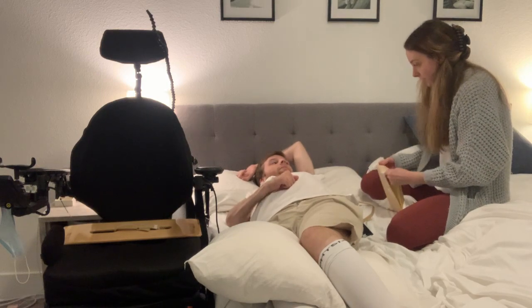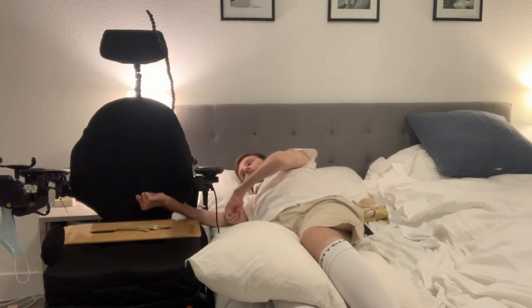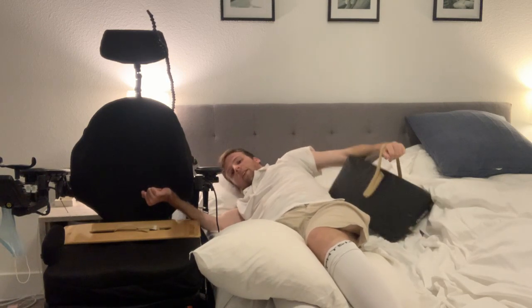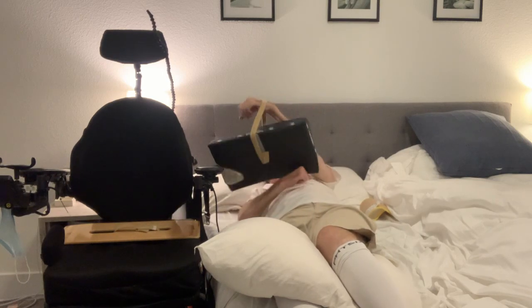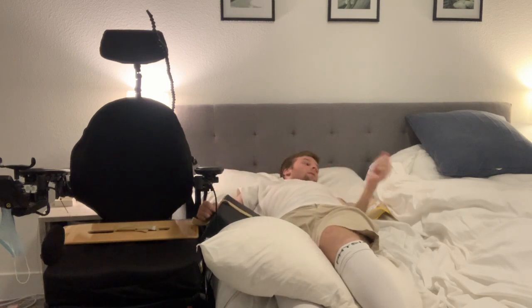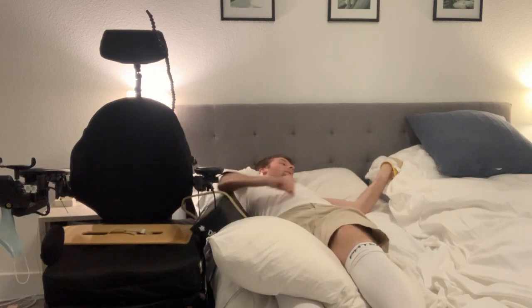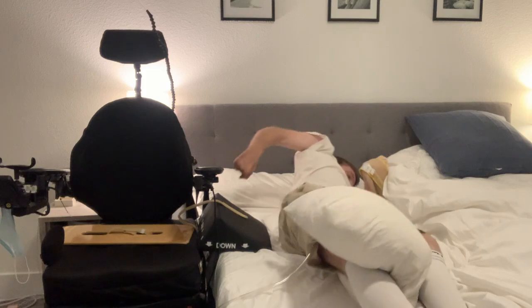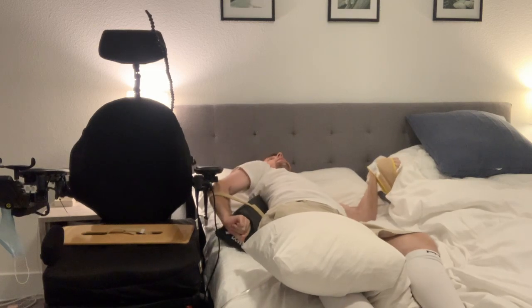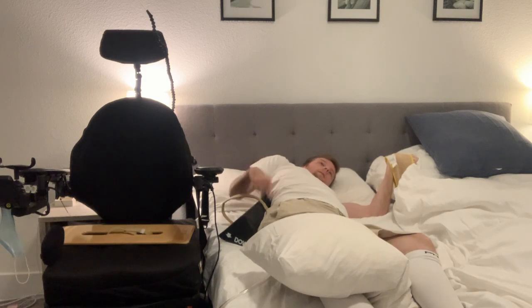So here's my independent middle-of-the-night roll-over: using my chair, I pop that out, put my hand in the strap so I can pick it up, fall on my back, set the wedge over here, then grab onto the Posey strap and roll myself over. Then I go back and grab the wedge and shove it under as best I can — there we go, does the job.